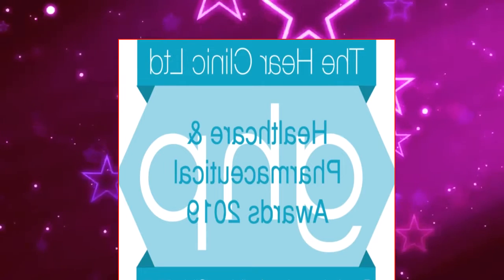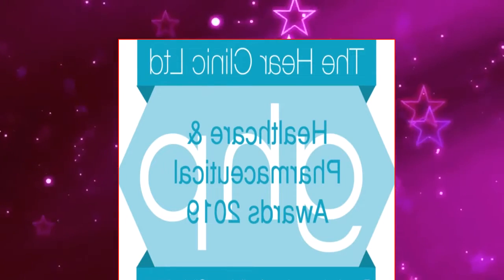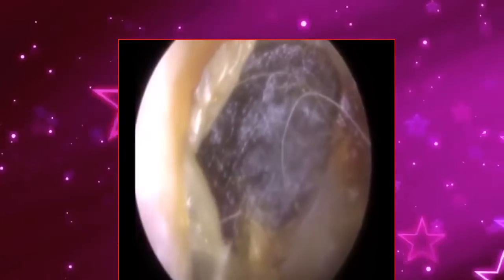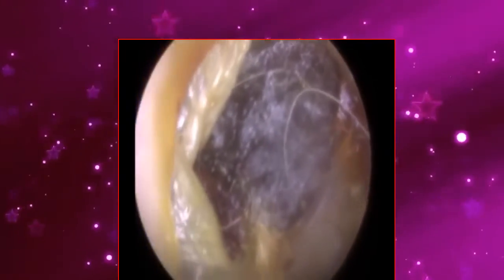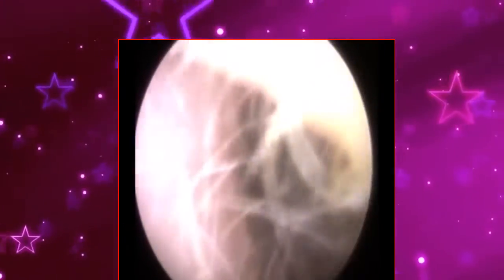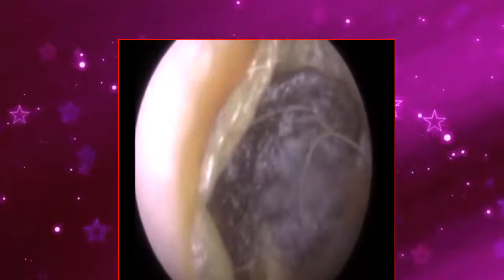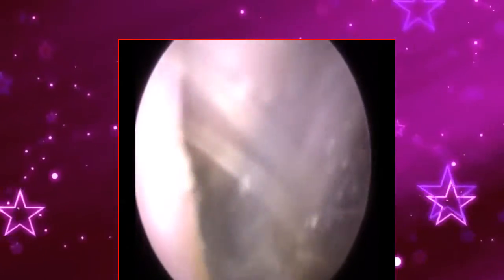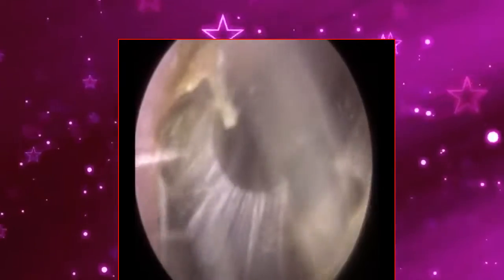Superior posterior quadrant of your eardrum, which is the top rear of your eardrum, and that cholesteatoma caused erosion of the bony part of the ear canal. The patient also underwent further surgery to remove some of the mastoid bone because that got infected because of the cholesteatoma. A cholesteatoma is a collection of dead skin that collects in a pocket at the top of the eardrum in the pars flaccida, or what we call the attic.